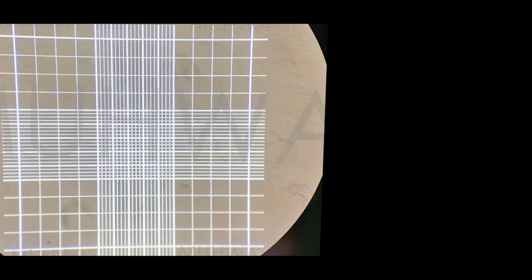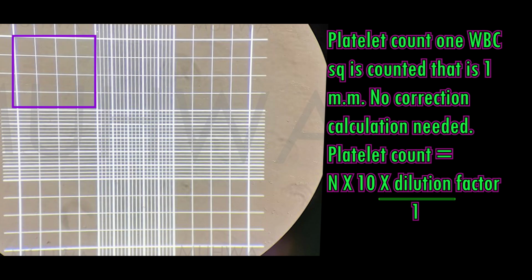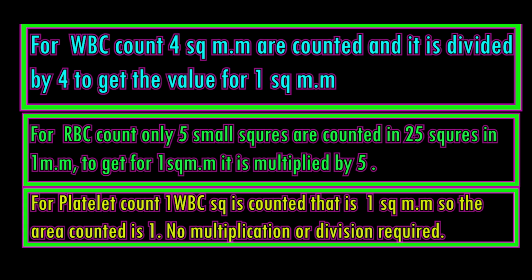For platelet count, we count 1 WBC square, that is 1 square millimeter, so the counting area is 1. So there is no multiplication for platelet count. For any body fluid, the area counted is taken into account, and if less than 1 square millimeter is counted, the area is calculated for 1 square millimeter by multiplication. If more than 1 square millimeter is counted, the value is divided to bring it to 1 square millimeter.